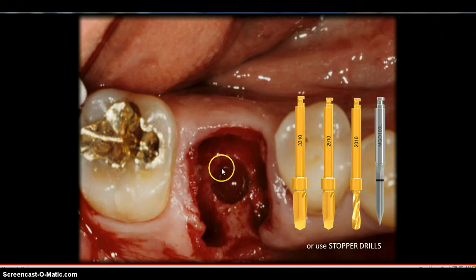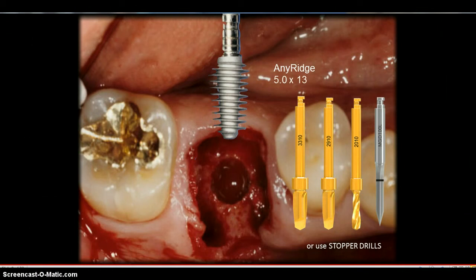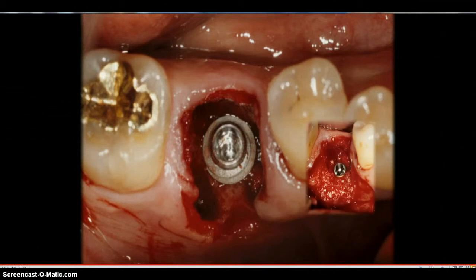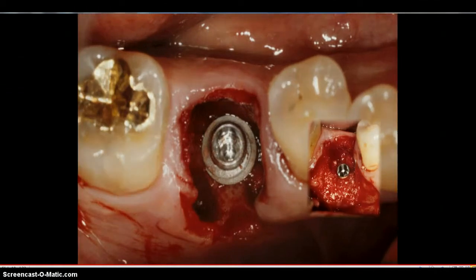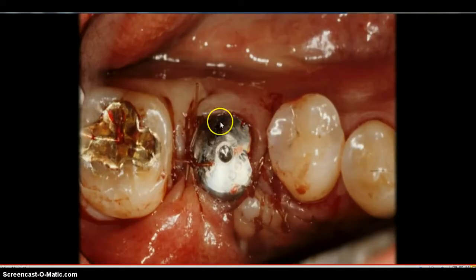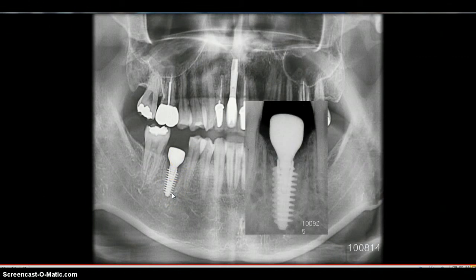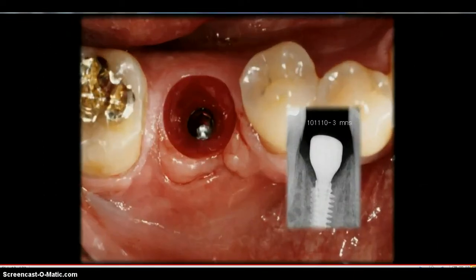We're going to be utilizing these 3 drills here in this osteotomy. We're going to place a 5.0 by 13 implant because it's a molar, so we can place a 5.0 diameter implant in this area. There's your implant in place, grafted bone, and a large flared healing abutment here. That's a 7 millimeter flared healing abutment. Okay, so look at your large flared healing abutment and what your natural emergence profile is going to be for this molar. Look at that as far as the healing abutment goes and the implant relative to the implant diameter.